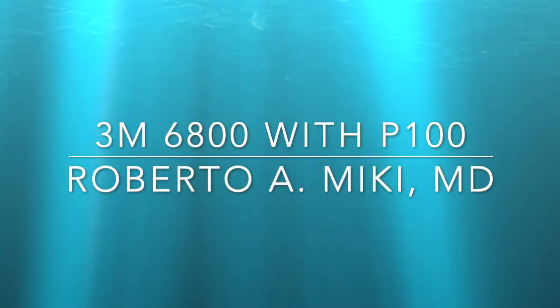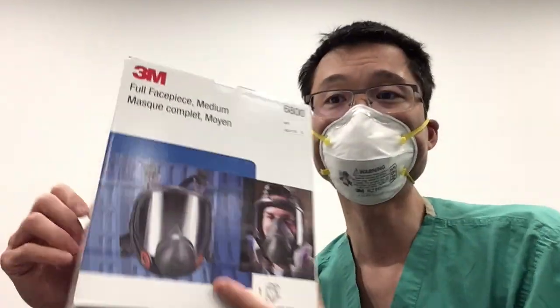Hi everyone, it's Roberto Mickey again and we're going to be reviewing a 3M 6800 full face mask respirator with P100 filters. Like in our last video, we're also going to be checking it out with our particle counter.